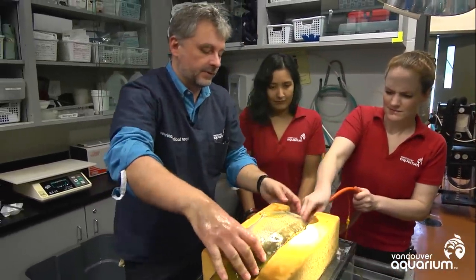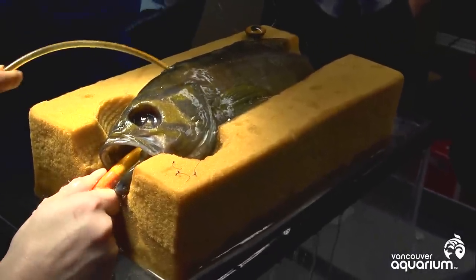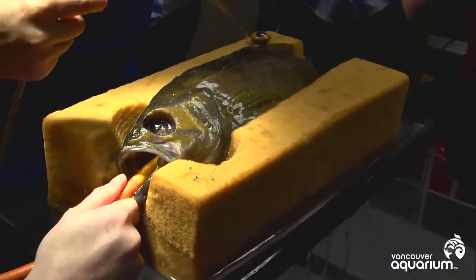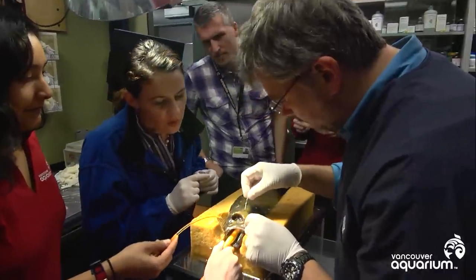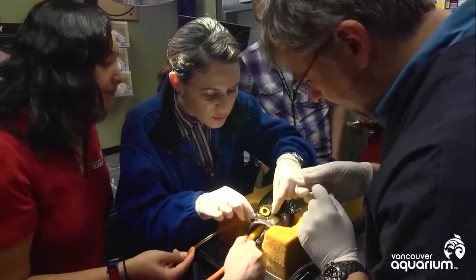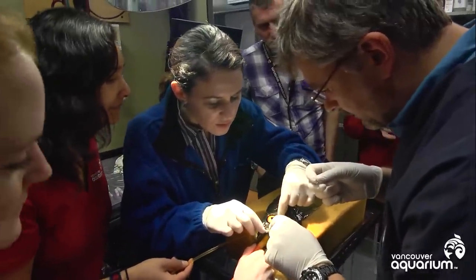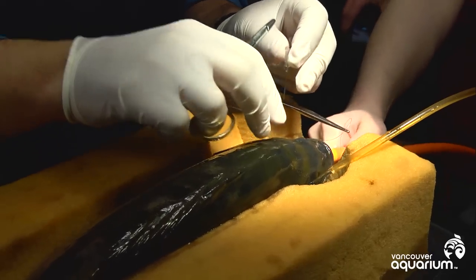It's going to be a little bit floppy here, so just be careful. So where do you do them — like there, there, and there? Yeah, so I always put it up against the fish, because each one is a little different. You probably don't want one in the nose. Yeah, so you can move it — like you could do it there. Okay, that worked okay.